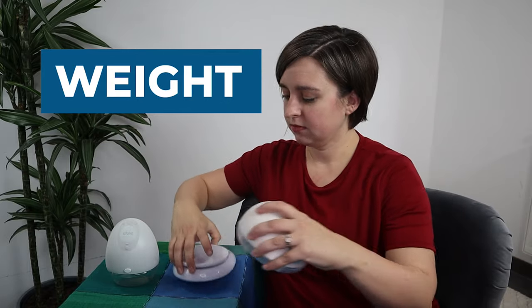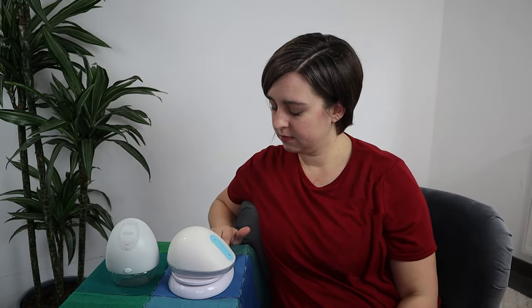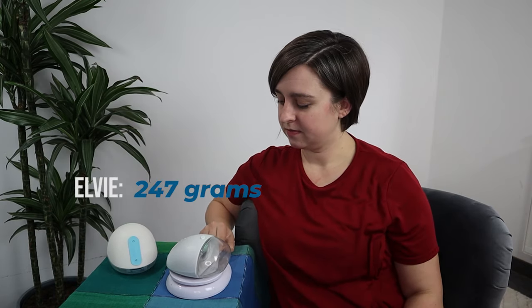Next let's check out the weight. The Willow is 364 grams — that's 12.8 ounces. The Elvie is 247 grams — 8.7 ounces. Point for Elvie on that one.